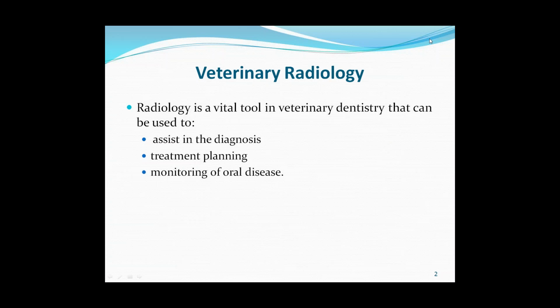In particular, we can use it to assist in the diagnosis of disease, which is probably going to be about 75 to 80% of the work in a normal practice, to diagnose diseases such as periodontal disease, for example, loss of the structures surrounding the teeth.